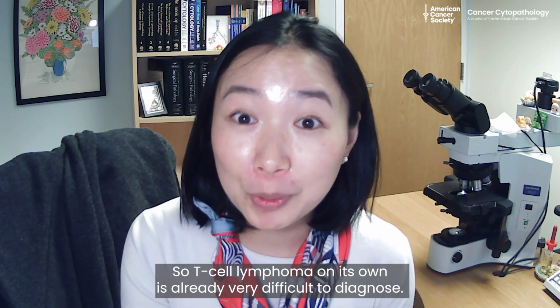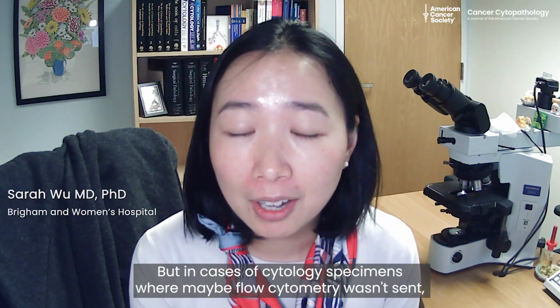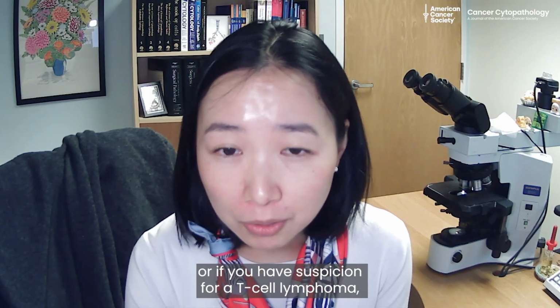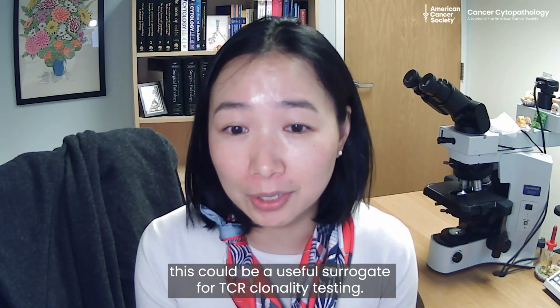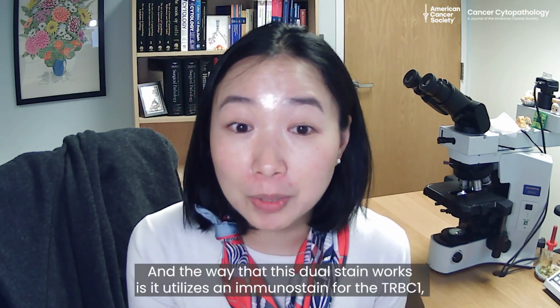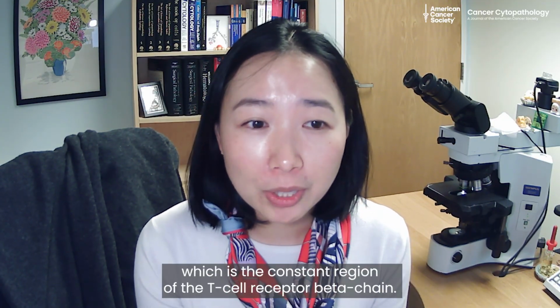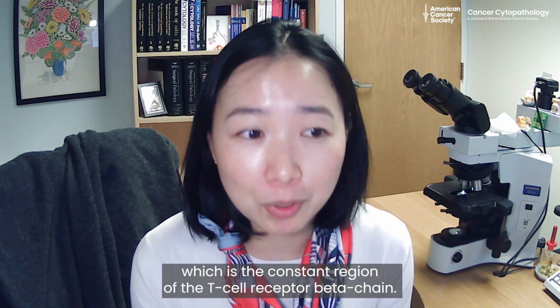So T-cell lymphoma on its own is already very difficult to diagnose, but in cases of cytology specimens where maybe flow cytometry wasn't sent, or if you have suspicion for a T-cell lymphoma, this can be a useful surrogate for TCR clonality testing. And the way that this dual stain works is it utilizes an immunostain for the TRBC1, which is the constant region of the T cell receptor beta chain.